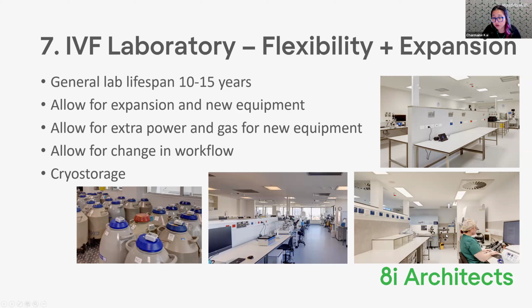This little lab on the bottom right-hand corner is a brand new facility that didn't exist before. We've designed it straight up to do about 1,500 cycles. It will take them time to get there, but it'll allow for that. The extra space we've allowed for, which was originally for extra incubators, they're now looking at using to do PGT because they've got space to do it. So they can add extra services for the patients as a result of the growth.